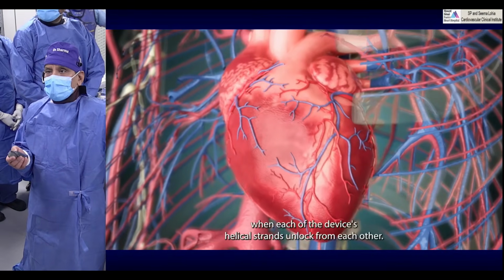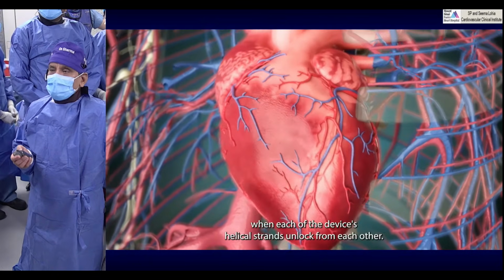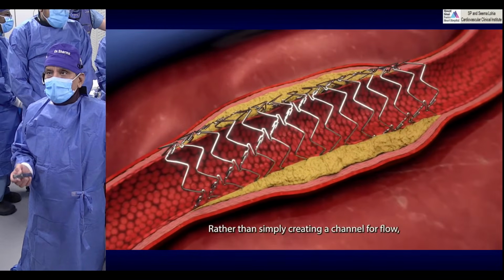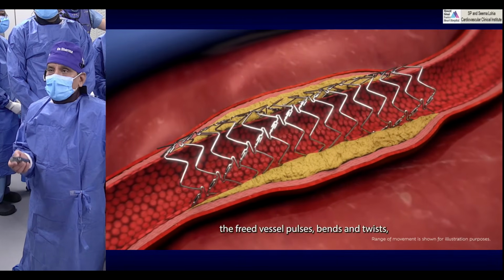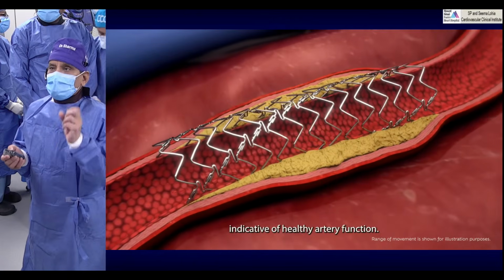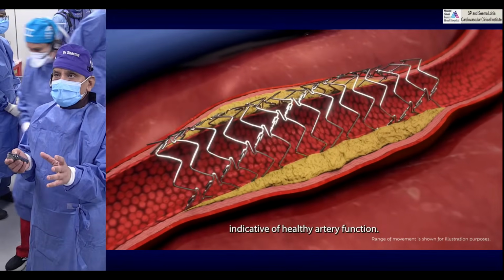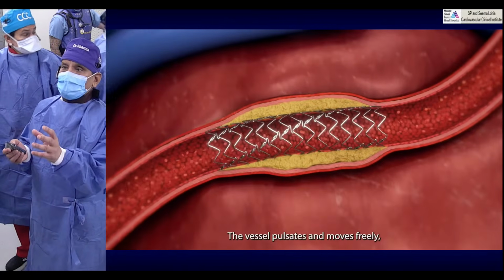And that was the whole restoration of vessel vasoreactivity, which is the one important identification of this device compared to our stents, which are fixed. So therefore, in the bioabsorbable stent era, we hoped that vascular pulsatility would come back.